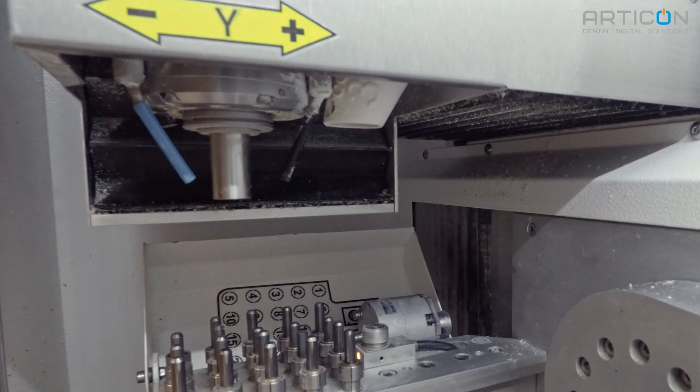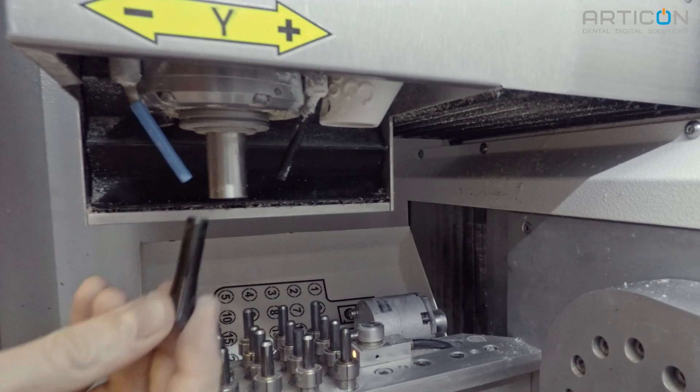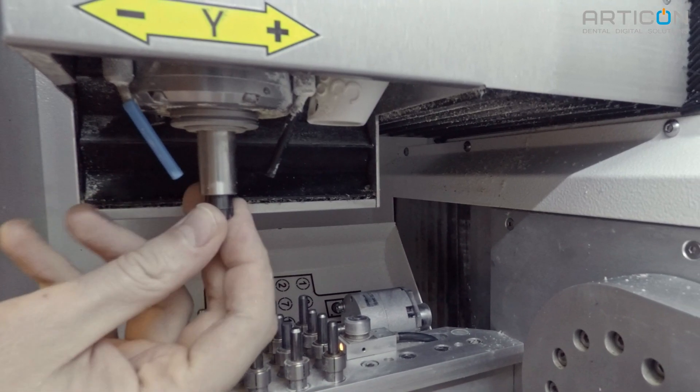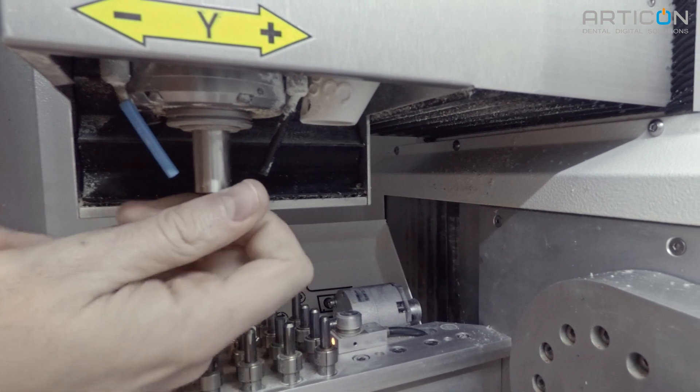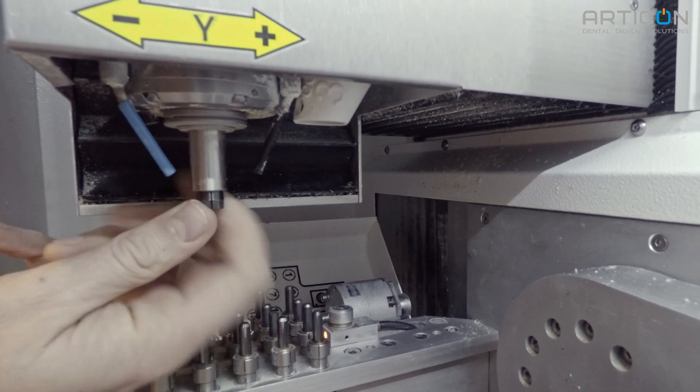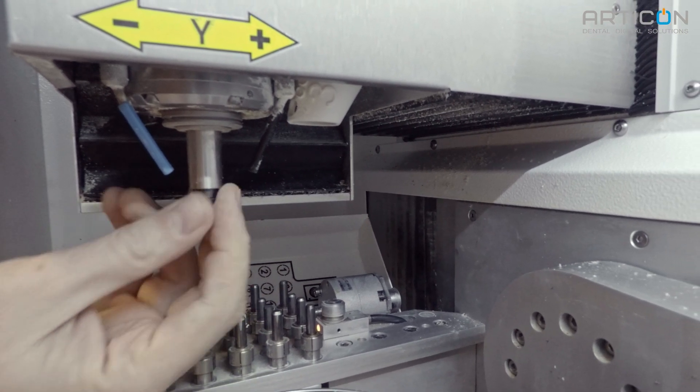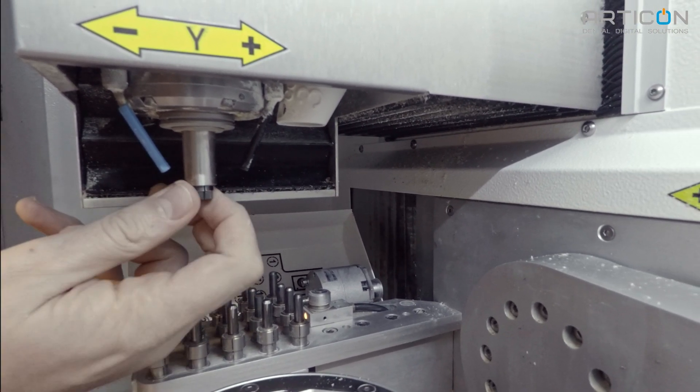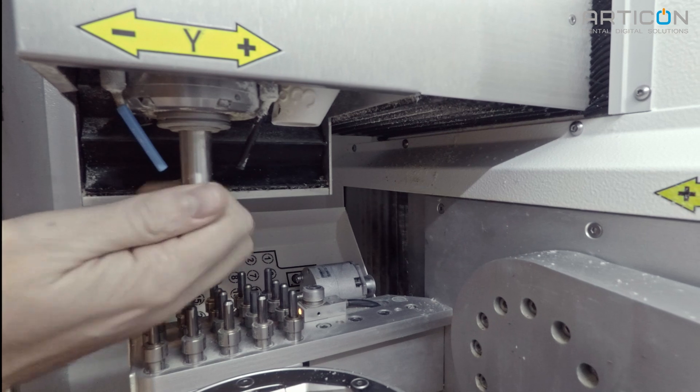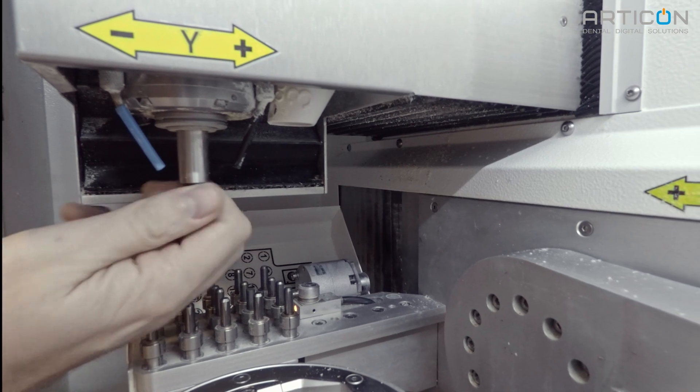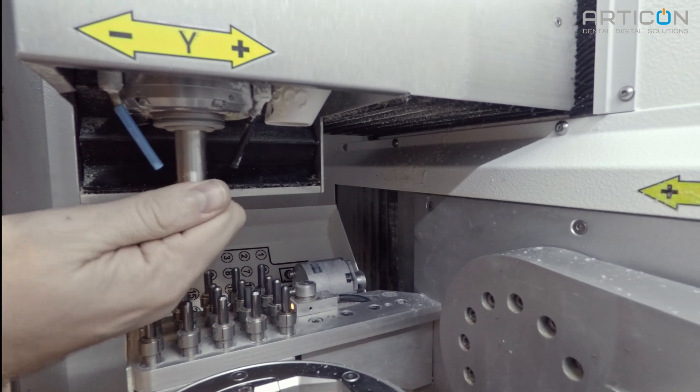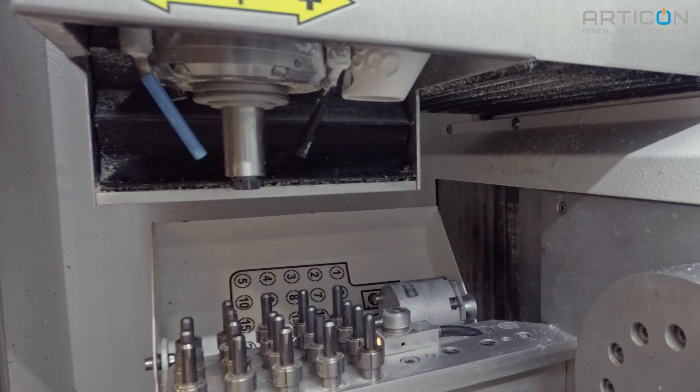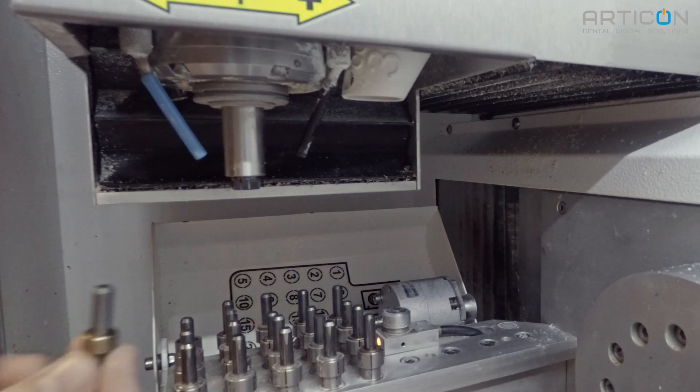Screw the collet back into the spindle shaft by hand up to the stop. If you are unable to screw the collet in by hand to the stop, you can use the collet removal tool but do not force it in. Stop as soon as you feel that it starts getting tight. Now make this test.